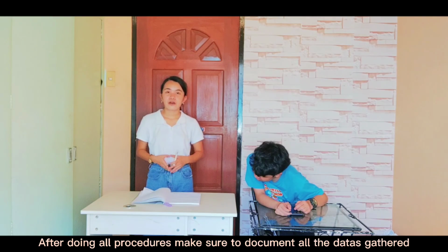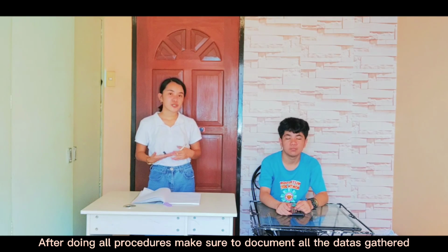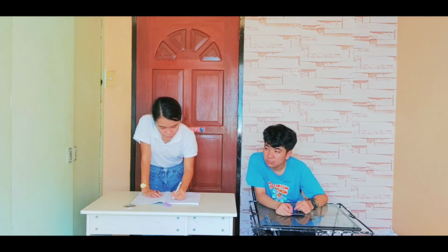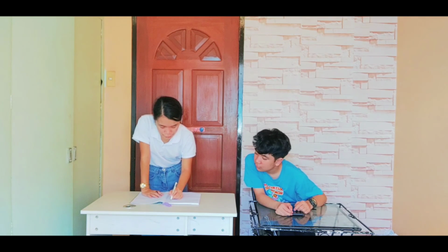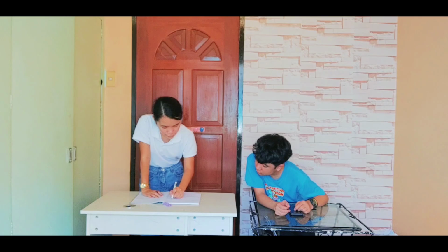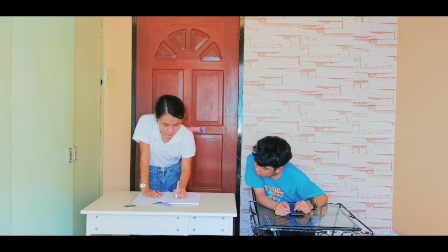So after doing all of the procedures, we have to make sure to document the data that we gathered earlier. So sir, your blood pressure is 117/80. Your temperature is 36.5. Your respiratory rate is 18. And your pulse rate is 95.